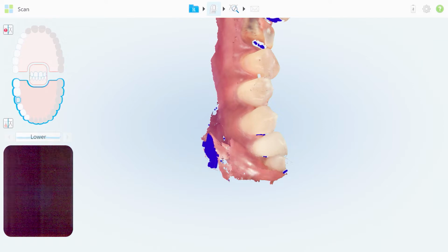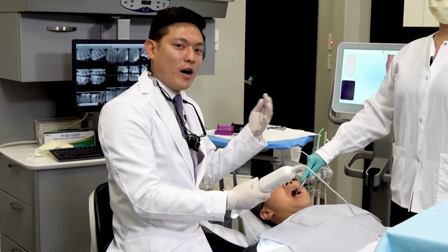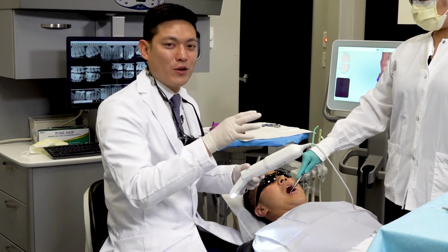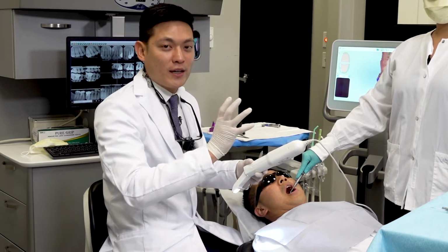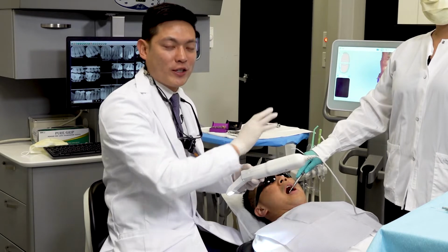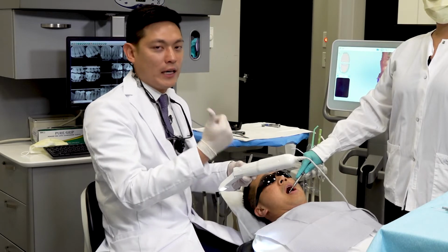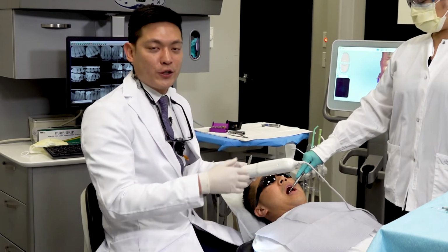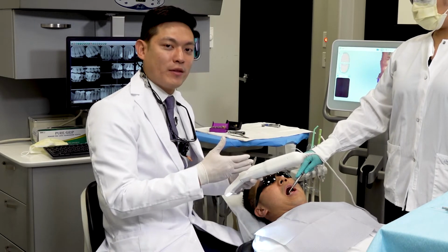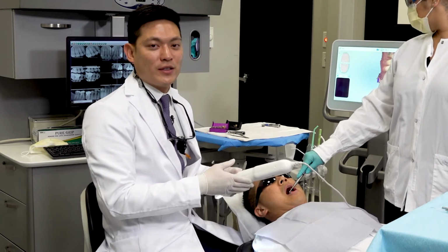But one of the critical aspects during the scan is to analyze the model, the digital model as it's generating. Watch the screen, watch where you're positioned, and watch the data get added to your model. If you notice any strange area, like you know where you're scanning over the canine, but for some reason the system put it at a weird angle or an incorrect position, you want to try to catch that early on, because if that happens due to a misalignment because of the area being too wet or too hard of a rotation, that certainly can throw off the accuracy of the scan. So it's ideal to capture it then, delete those areas that are incorrect, and then continue on with your scan. Sometimes it might be even easier to just start over.